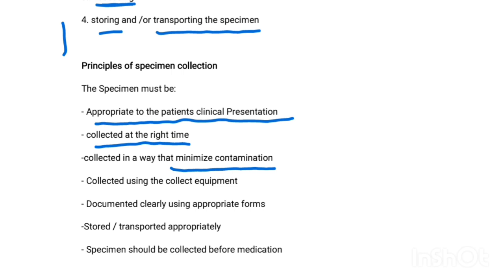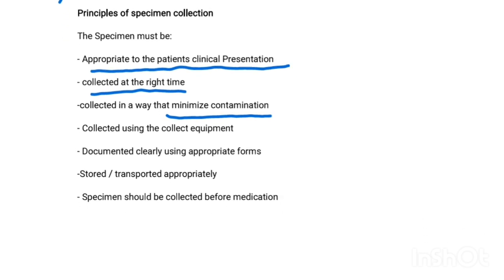The organism that is identified may just be a contaminant. So we need to make sure that we collect in a way that minimizes the contamination.